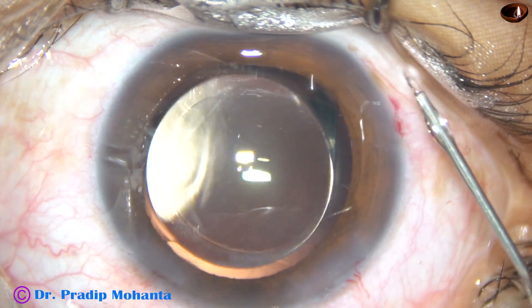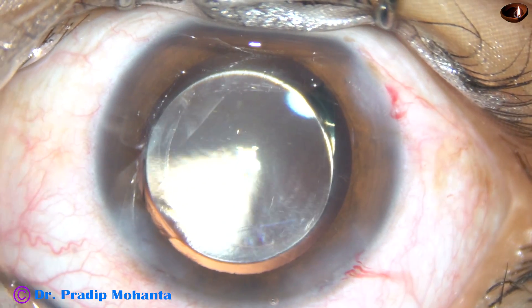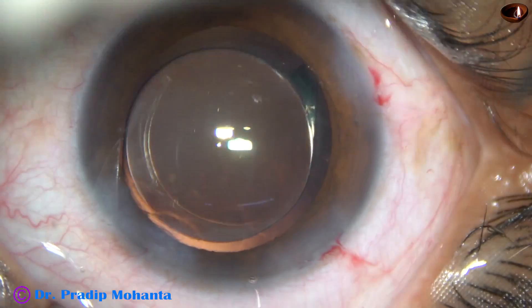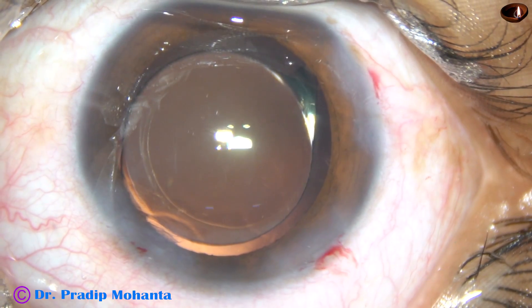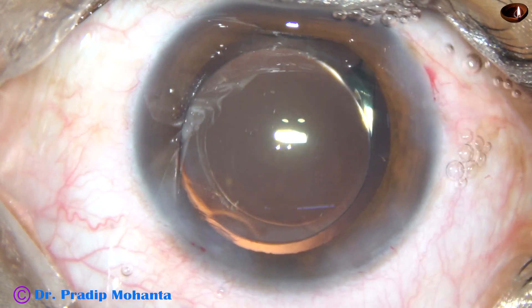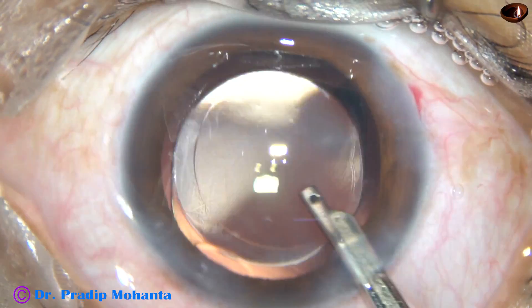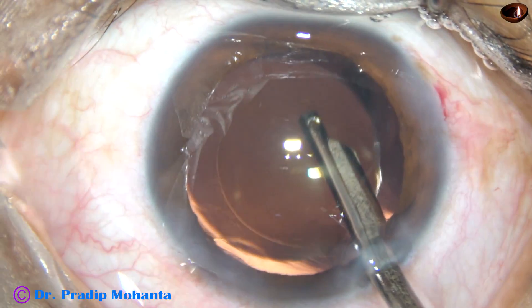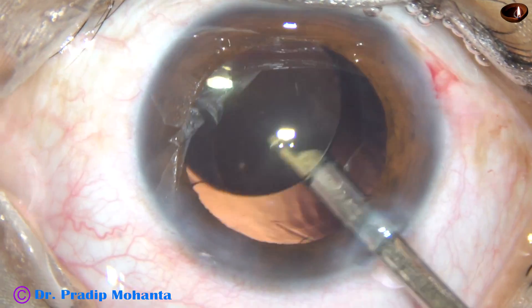Now is the time to close the case. The paracentesis openings are closed by hydrating the corneal stroma on either side of these stab wounds. I construct the main wound in such a way that it does not require any hydration most of the time — 99% of the time. And now this is the final lavage of the anterior chamber; I do this in all of my cases and I get a very clear anterior chamber.